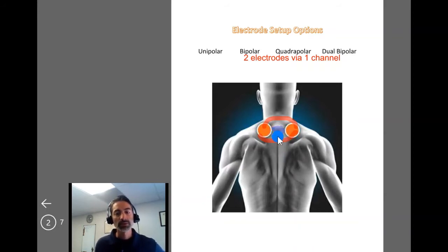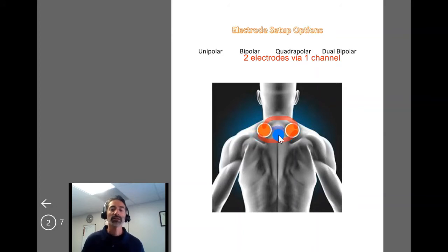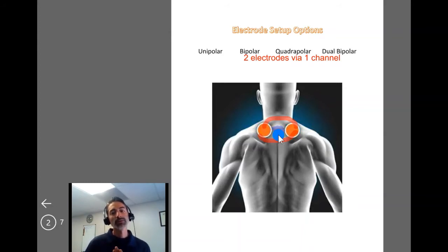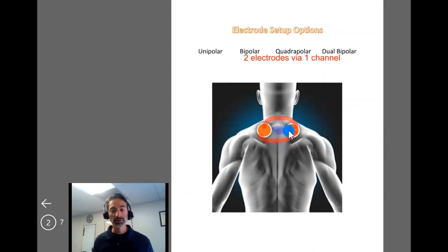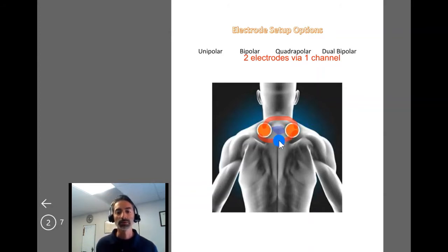This setup is generally safe for the spinal cord because bone is covering it. However, if there were a laminectomy where bone would be exposed, you wouldn't necessarily do this setup. Similarly, if there are metal screws, rods, or other implants within the spine, you likely wouldn't do any e-stim procedure crossing over the spinal cord — though you could still do e-stim longitudinally on the right or left side. As long as the lamina is protecting the spinal cord and there's no interfering metal, this bipolar setup is safe.